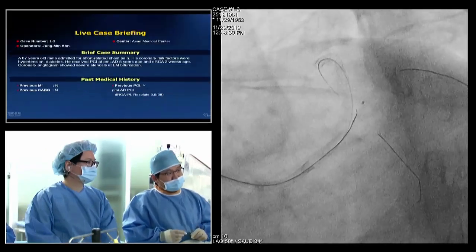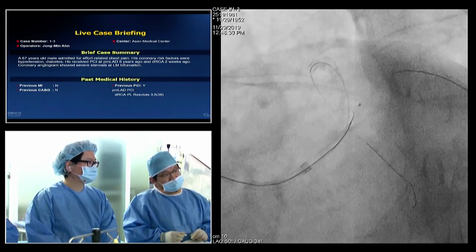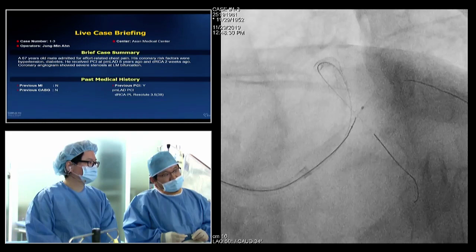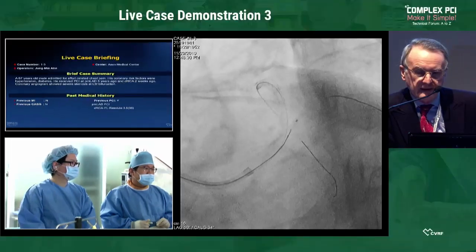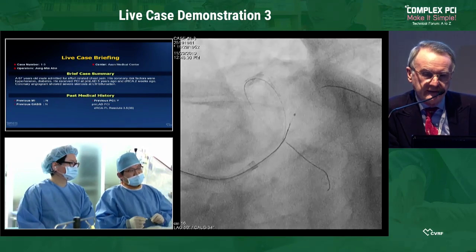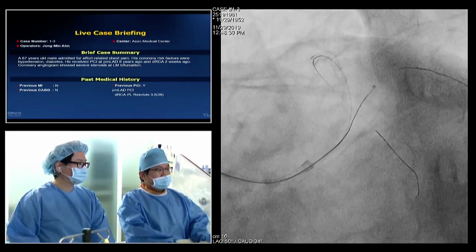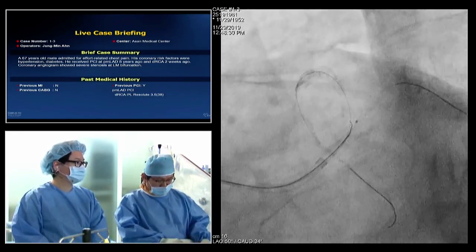Yeah, it could be one option. I already made a very big angle, but the inside of the artery angle is flattening. This catheter seems to have the opening facing the opposite side. I don't know if you turn the dual lumen catheter. The lumen is not big enough to accept your big curve, so you need a smaller, more acute curve. I think it's better. Yes, and you can also try the angulated.